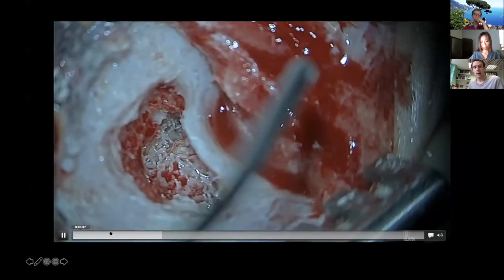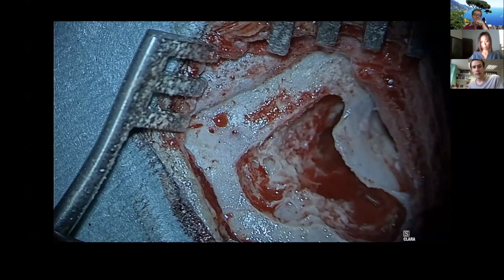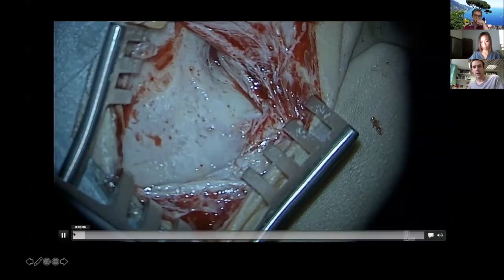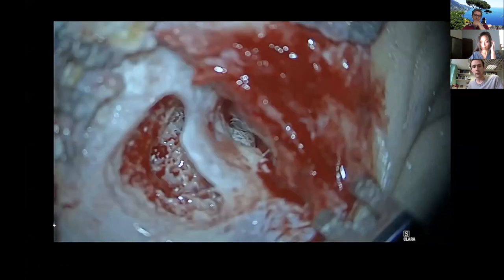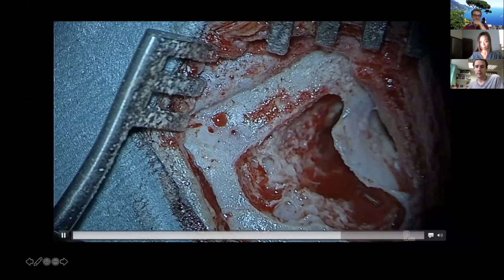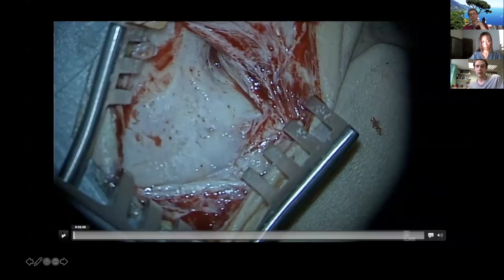organisms. Now, as you can see from the surgery, as soon as the periosteum is taken off the bone, you can see that you've got leakage of CSF throughout the temporal bone. You can see leakage through holes in the ear canal, leakage into the middle ear, posterior, superior to the cortical mastoidectomy, even from the mastoid tip, and this video shows that.